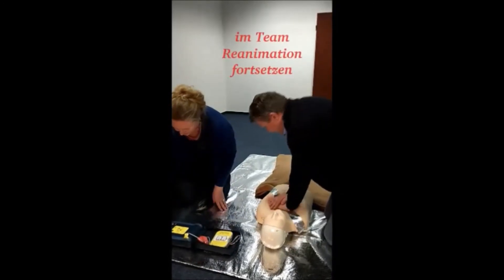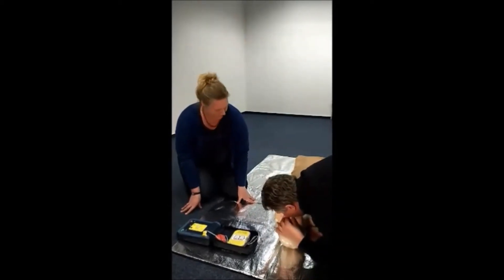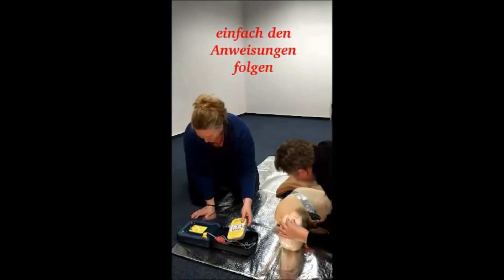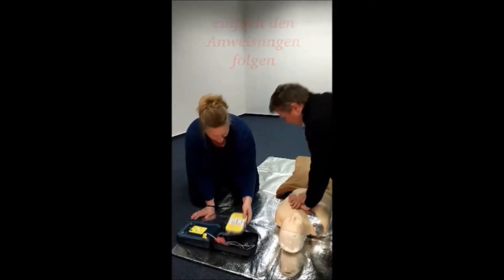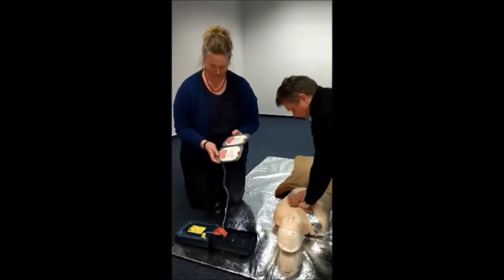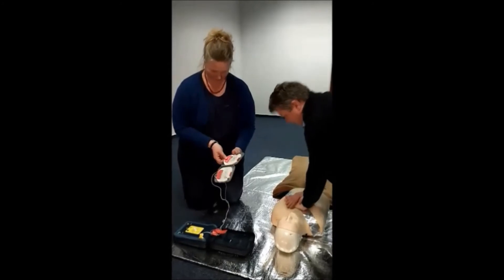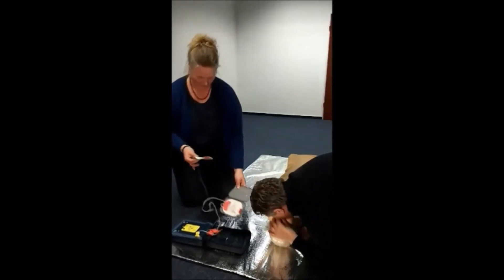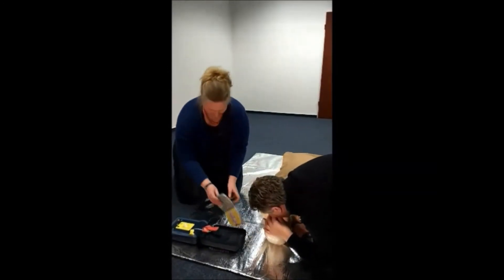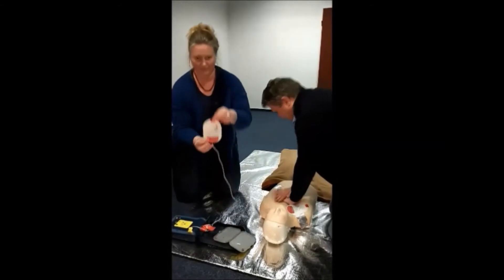Das Gerät gibt Anweisungen: Alle Kleidungsstücke vom Brustkorb des Patienten entfernen. Wenn der Brustkorb freigelegt ist, die graue Elektrodenkartusche nehmen und die Abbildungen auf den Elektroden genau beachten. Eine Elektrode von der blauen Kartusche abziehen. Elektrode genau wie abgebildet anlegen. Fest auf den entblößten Brustkorb drücken. So weit die erste Elektrode angelegt.